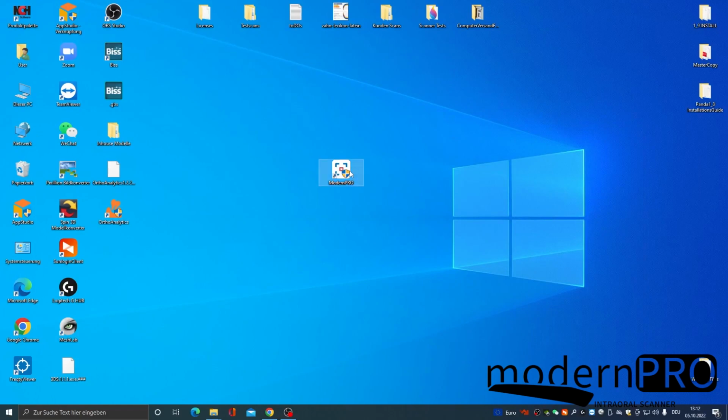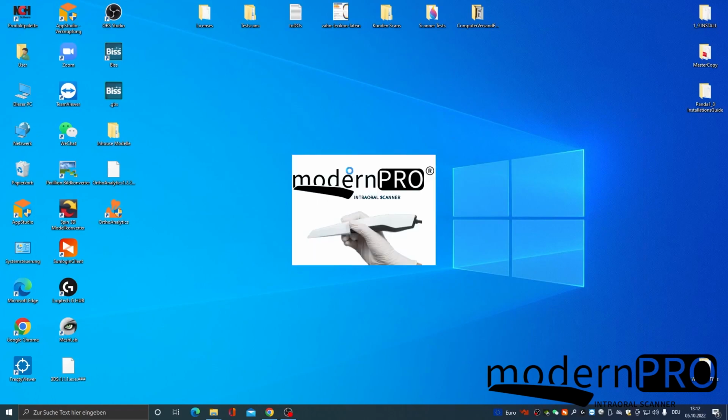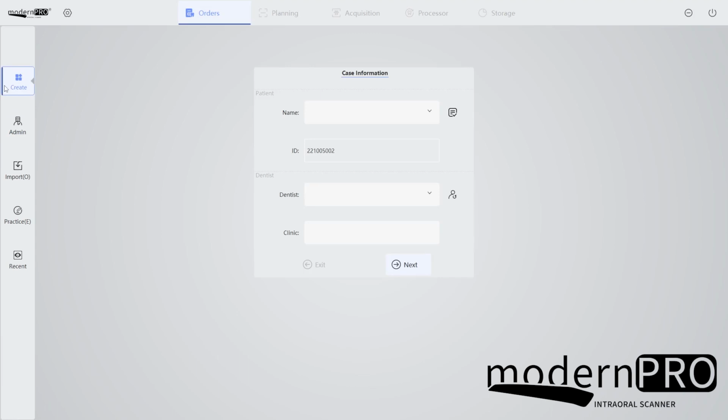First step, we open the program. We select Create and enter our patient's name, in this case Josh. Our personal name, the name of the dentist that is actually working with the patient, which in this case is Max, and the name of your clinic, of course.